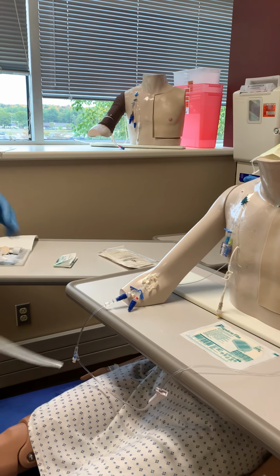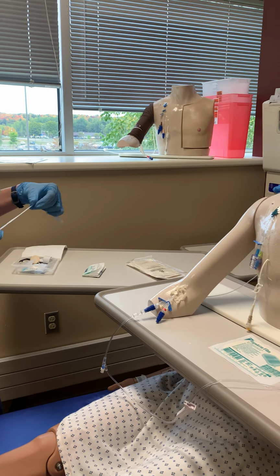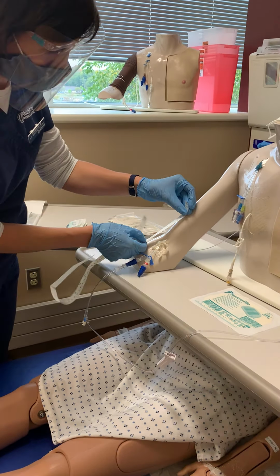I'm going to measure 6 inches up the arm from insertion, and then I'm going to measure in centimeters, and I'm going to compare that against the baseline in the chart. I already looked at the chart, and this is darn near the same. If it was more than a 1/2 inch variance, that would alert me to potential phlebitis, infiltration, or other issues with the viability of the PICC. But everything is good there, so I'm not gonna worry about that.